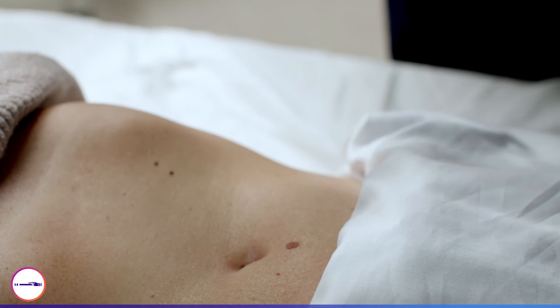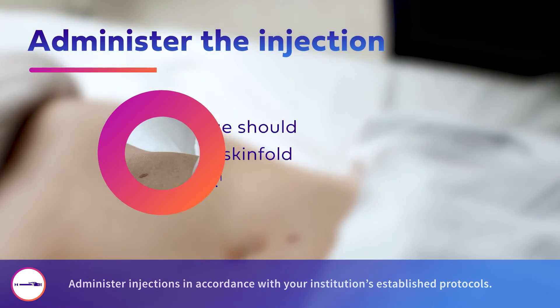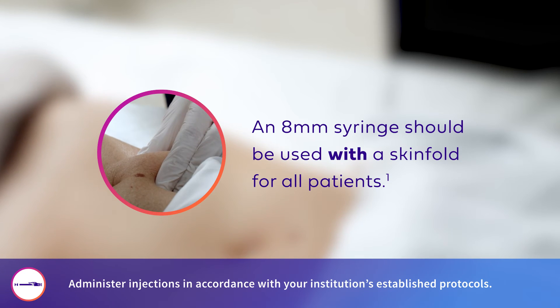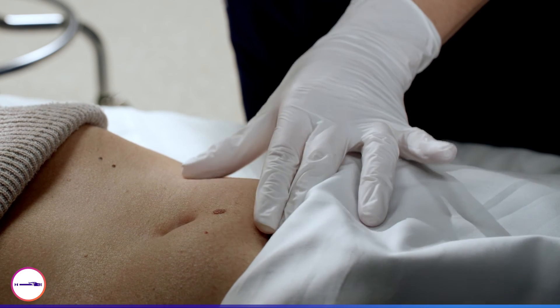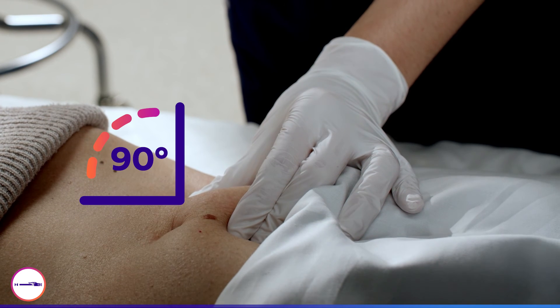Once the injection site has been selected, disinfect the skin. Injections should be given into a lifted skin fold when using a BD SafetyGlide Insulin Syringe with an 8mm needle. Gently lift a skin fold. Insert the needle at a 90 degree angle to the surface of the skin fold.